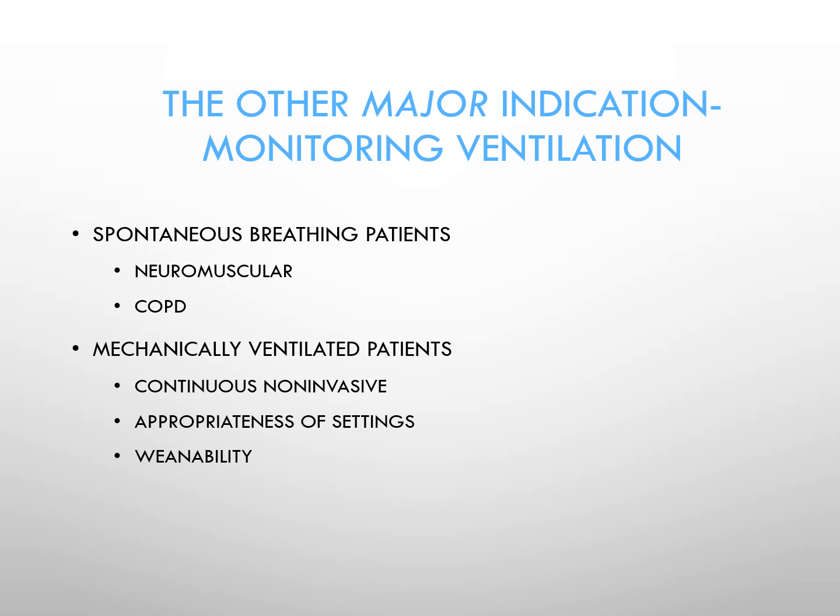Also with mechanically ventilated patients, end-tidal can be very useful when, for instance, patients are being assessed for weanability. If their end-tidals are very high, they may not be a candidate for weaning. Or if they are weaning and we see a trend where their capnography is increasing over the course of hours during the day, they may be tiring out. They may need to be put back on full support.